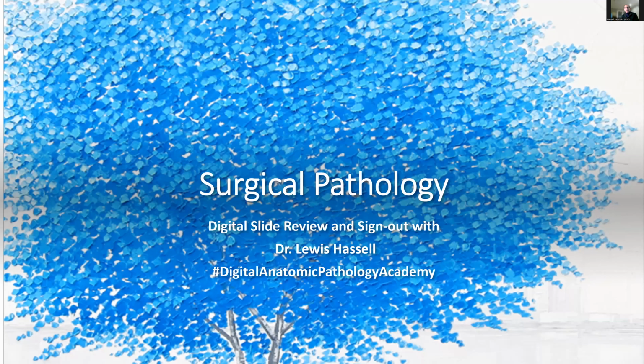Our case today comes from the realm of GI pathology and is a somewhat unusual case, although I think we can all learn something just about every day if we're paying attention.